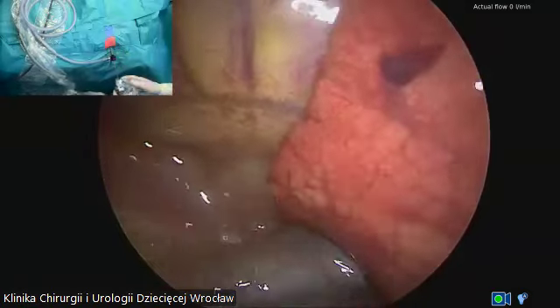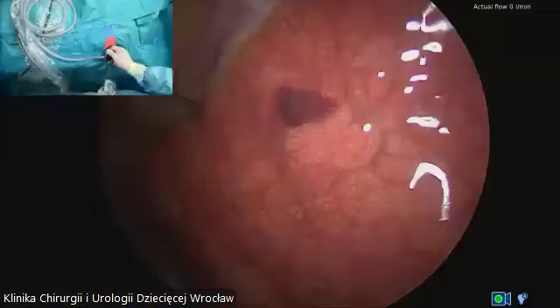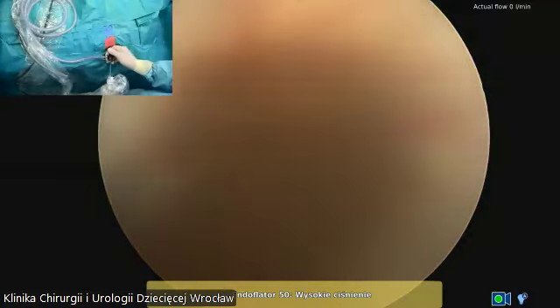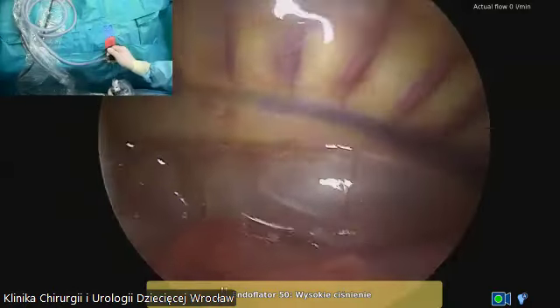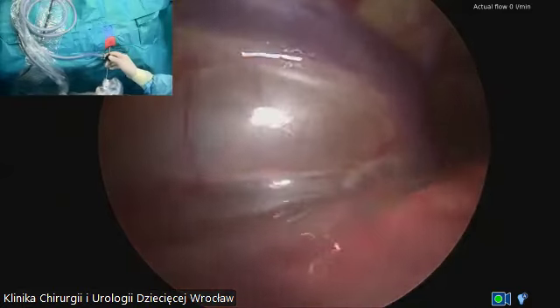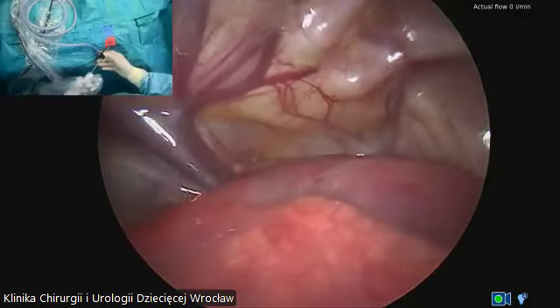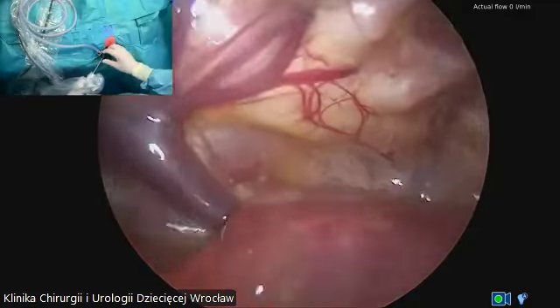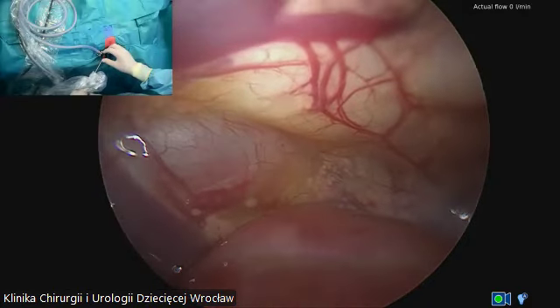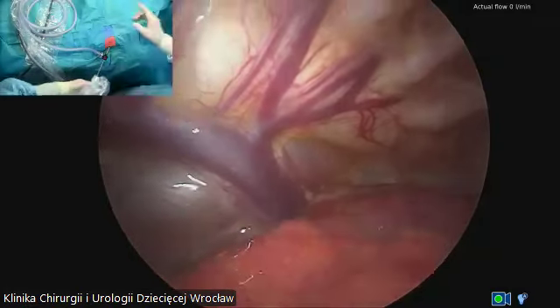That's a usual story, that the lung sticks to the pleura. So just wait a moment, find a good place to take it down with the tip of the scope. You will see in a moment, yeah, that's it. You can see the hugely dilated distal pouch. We can even see perfectly the fistula site. You can see here how very distended it is. Okay, keep the camera.